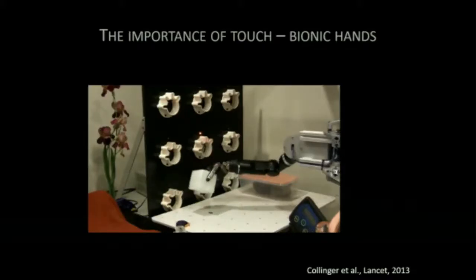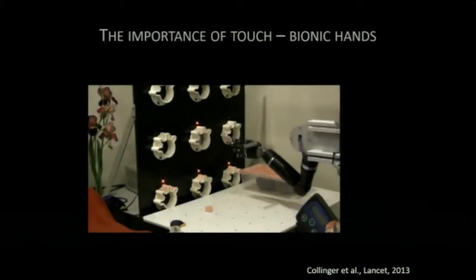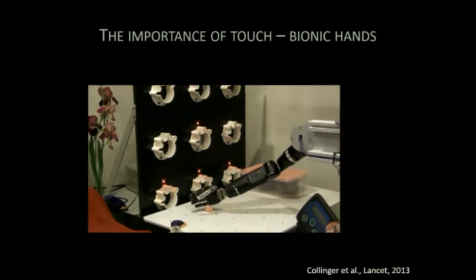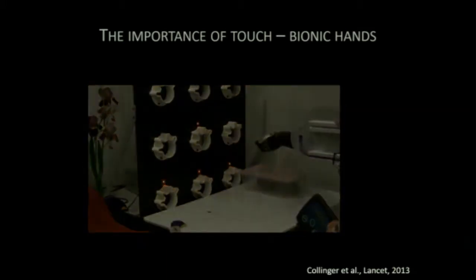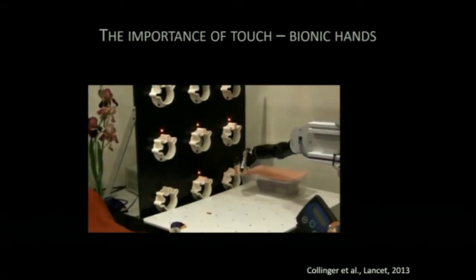Now, in the context of a brain control prosthesis, this is a movie that was made by my colleagues at the University of Pittsburgh. This is Jen here. Maybe a lot of you have already seen this. She's tetraplegic. She's been implanted with an array of electrodes in the primary motor cortex. This is the part of the brain that sends signals to the muscles to move the arm. And my colleagues at Pitt, and there's a cottage industry of people doing stuff like that, have devised algorithms to read these signals from primary motor cortex and infer the intended movements.